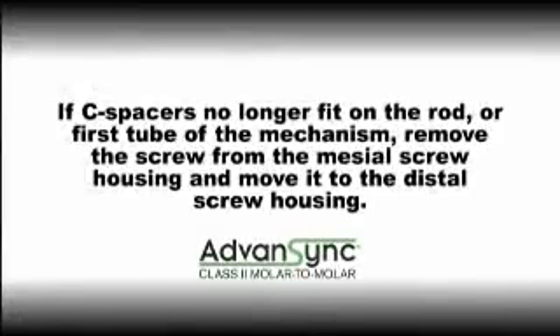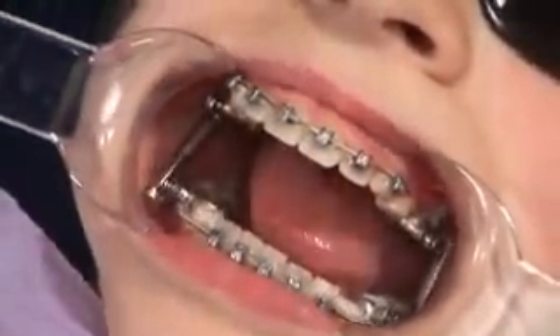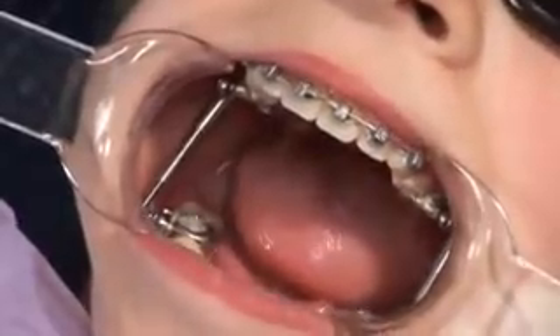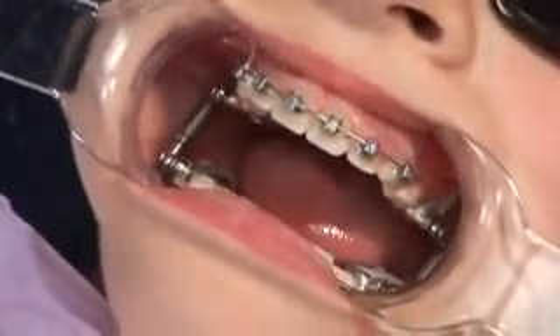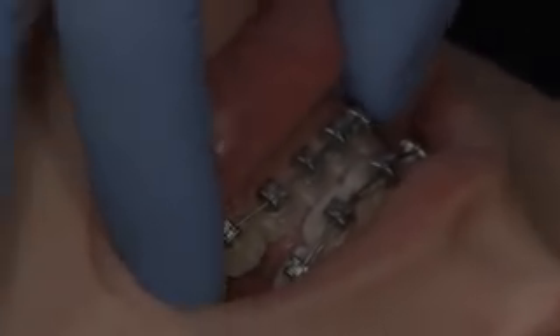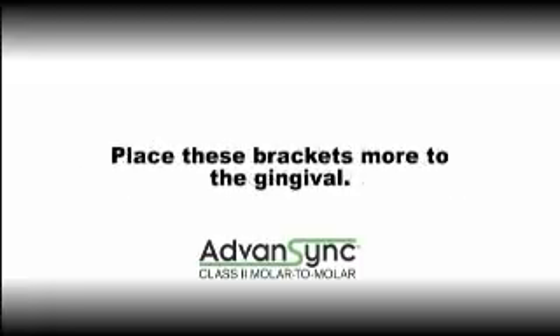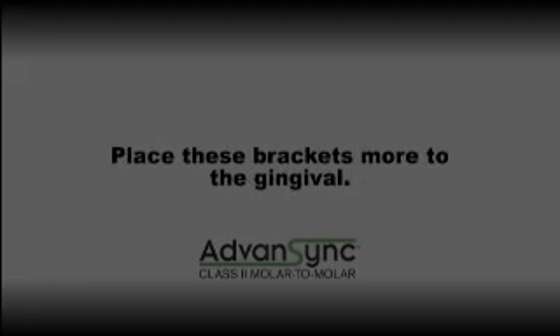If C-spacers no longer fit on the rod or first tube of the mechanism, remove the screw from the mesial screw housing and move it to the distal screw housing. At each activation appointment, it's important to check that the telescope is functioning correctly, the midlines are in their correct relation, and to see if there is an open bite in the bicuspid area. If there is an open bite in the bicuspid area, the lower first and second bicuspid brackets will need to be rebonded lower on the teeth.